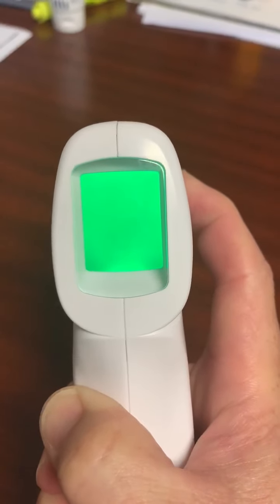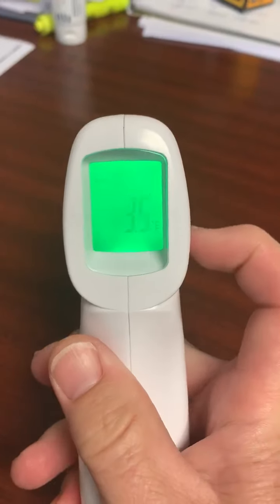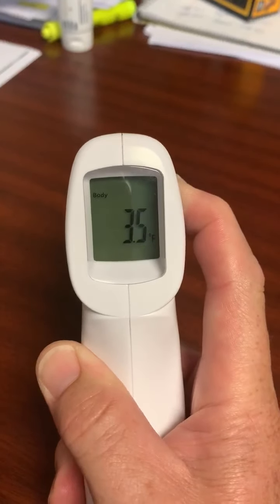I hit the memory button again and it takes me to F4 and the calibration number. Now I can see it's at 3.5. What that means is it's adding 3.5 degrees to my normal temperature.